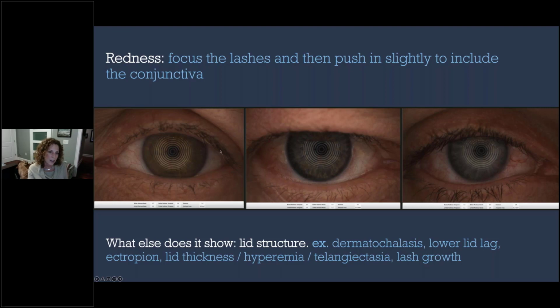But if they're out here and the tips of the lashes are in focus, and I tell them, all right, look at what's in focus, if that's what's in focus, you've got to push in. And really for my redness scan, that's my best starting point anyway: lashes and push in. I absolutely love this picture and I rely heavily on it because it tells me so much more than redness.